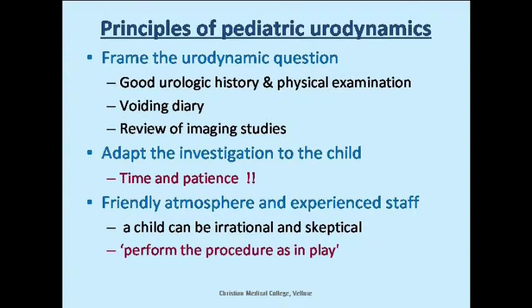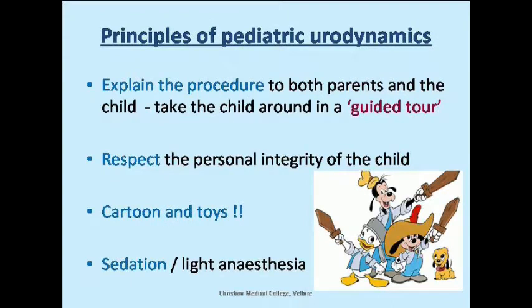So you need to know by proper history and physical examination, you must have reviewed all the imaging studies, and then the clinician must, in my department, when I see a clinician refers a patient for urodynamic evaluation, he has to specify what is his urodynamic question, what does he want the urodynamist to answer. And unless that question is put, we send back the request saying, please clarify why you want urodynamics. Because unless you do that, I think it will not fetch you the correct result.